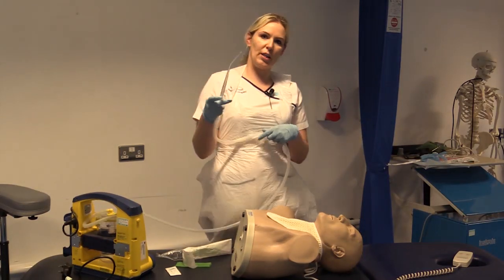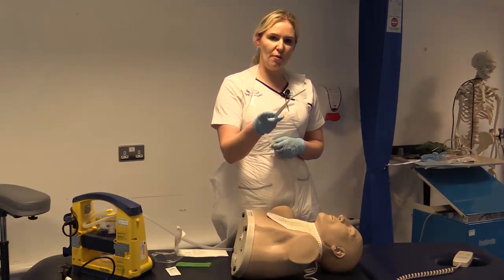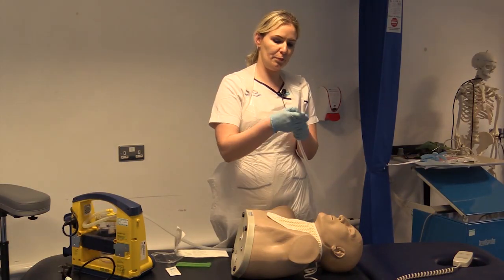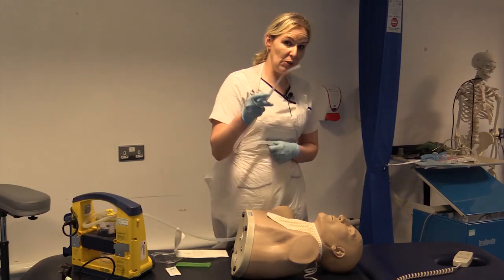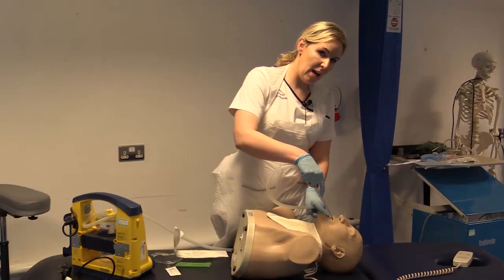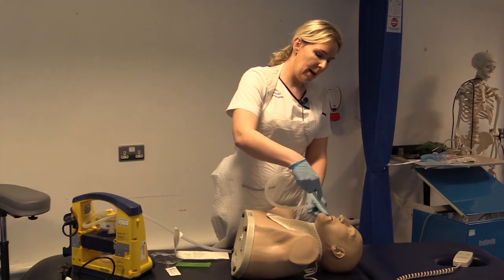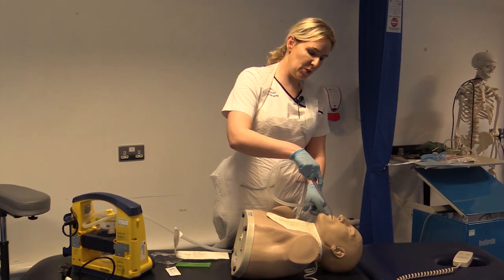Okay, again, you're going to explain to your patient that suction is going to occur. You're going to keep your suction off until you're into the patient's mouth. Okay, so you're going to gently insert the tip, apply your suction, and you're going to remove all visible secretions in the mouth. And as you withdraw, keep your suction on.